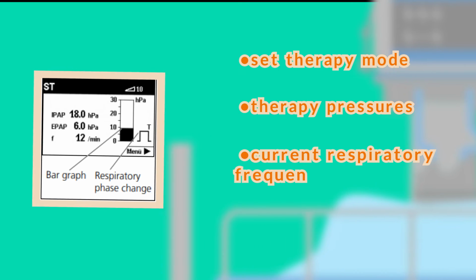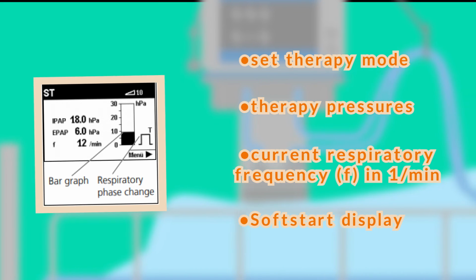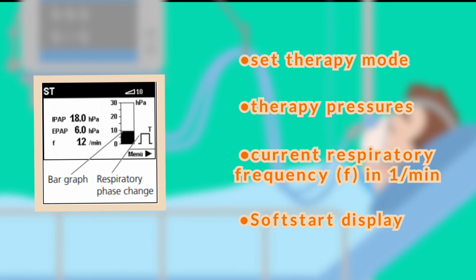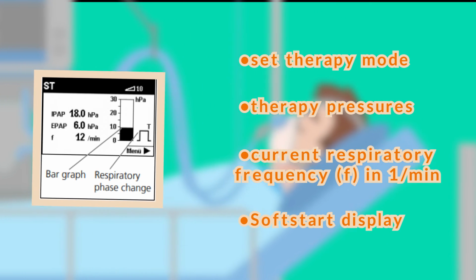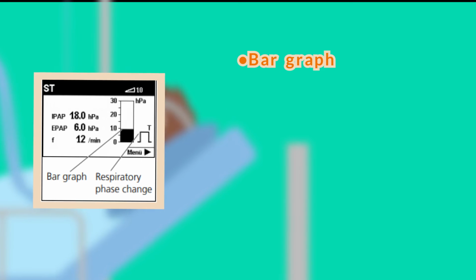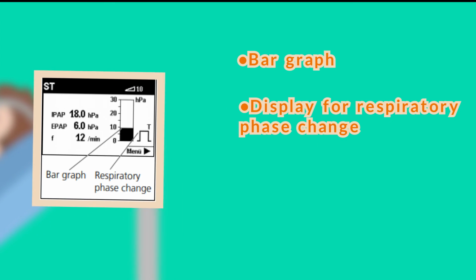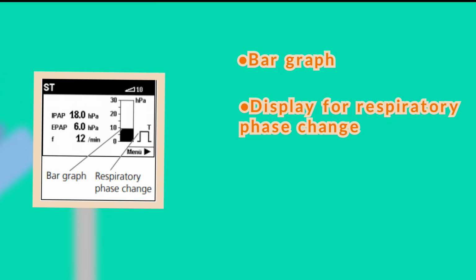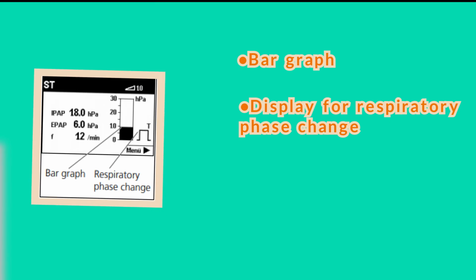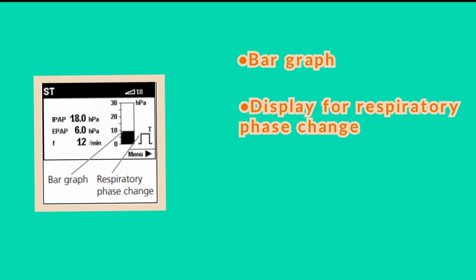Current respiratory frequency in 1 per minute. Soft start display, if activated, with remaining soft start time, maximum 30 minutes or the maximum soft start time specified by the doctor. Bar graph shows the pressure curve for inspiration and exhalation. Display for respiratory phase change indicates whether the current respiratory phase was triggered spontaneously by the patient or by the machine. The display also shows whether the inspiration trigger is plugged at the start of an exhalation.